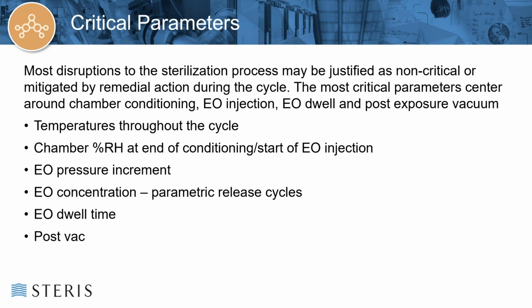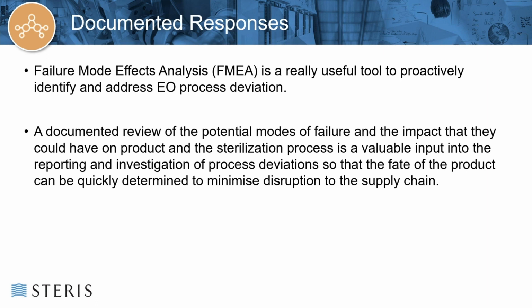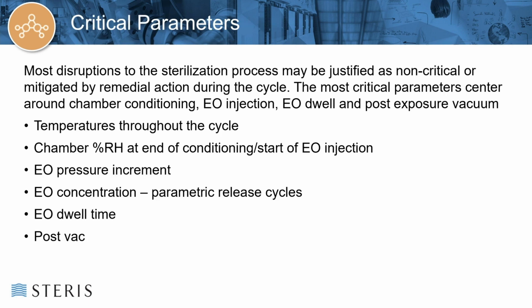So a documented review of the potential failure modes and the impact that they could have on the product and sterilization process is valuable. So document, document, document. Leave breadcrumbs for yourself. Don't let any stone go unturned, and document that it was turned.